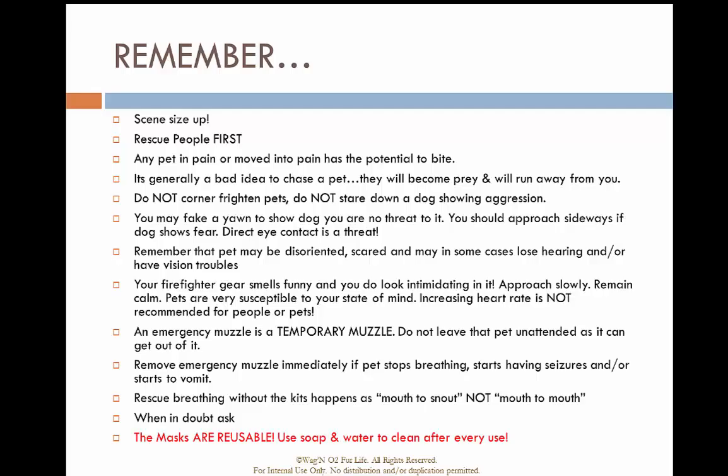Remove the emergency muzzle immediately if the patient stops breathing, has seizures, or starts to vomit. Rescue breathing without the kit is done mouth to snout, but preferably use bag valve mask ventilations with the Ambu bag and these pet oxygen masks. When in doubt, ask a question. When done, the masks are reusable — simply clean with warm soap and water and allow them to dry.